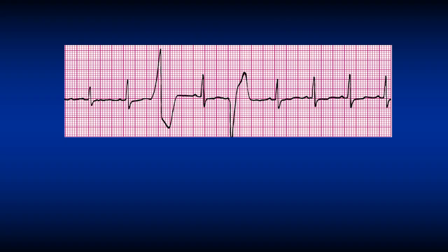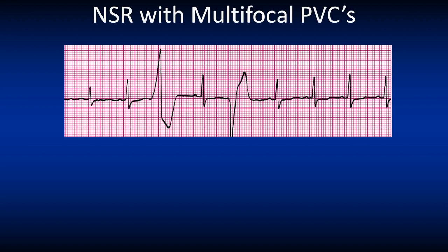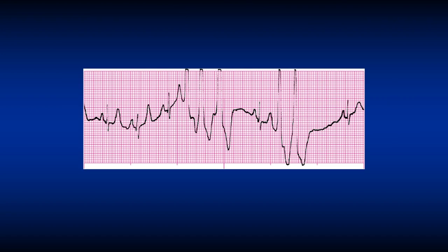Look at the PVCs — they look different, meaning they come from different areas inside the ventricle. This ECG is called a normal sinus rhythm with multifocal PVCs.